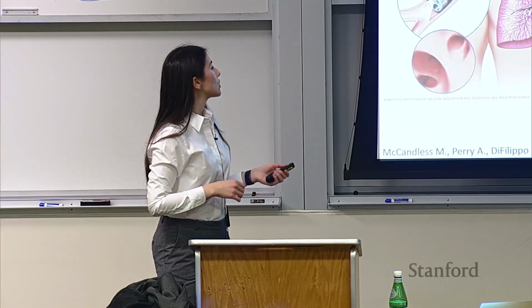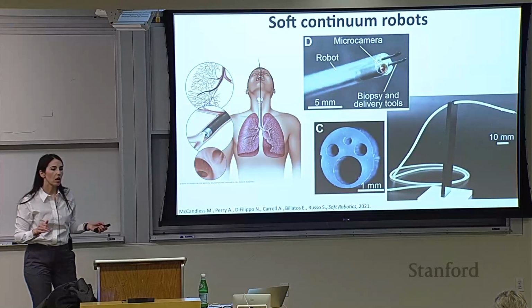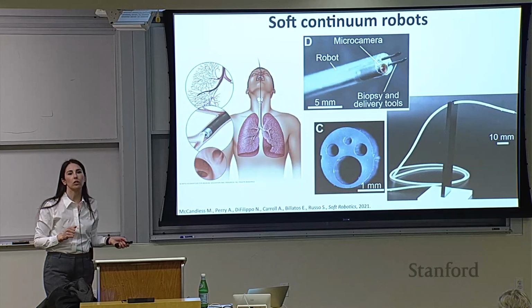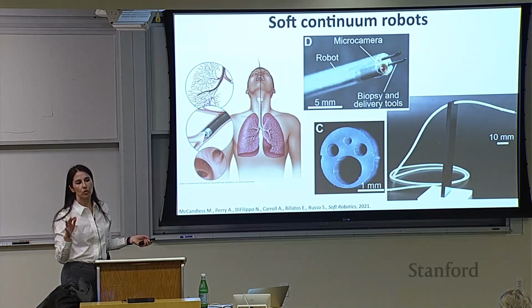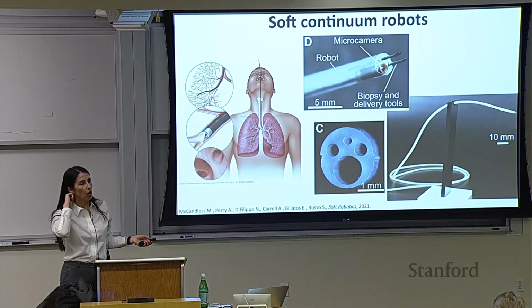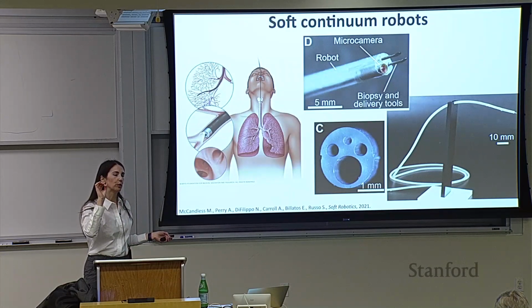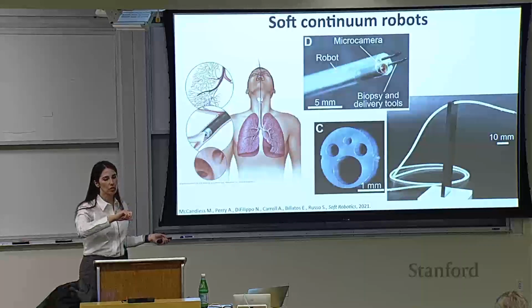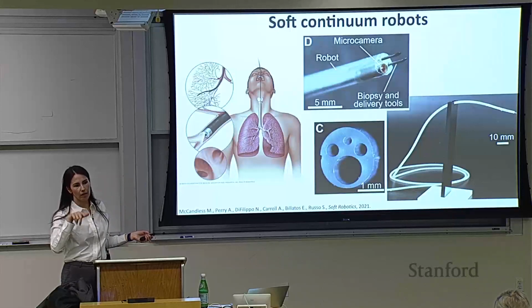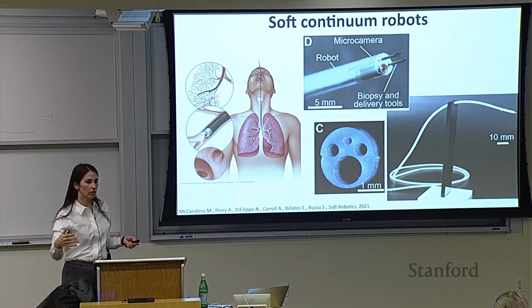Oh, yeah. So far, we still have to test it on live animal models. But if you're looking at a traditional bronchoscope, they typically range in diameter about 6 millimeters or so. There are some smaller ones, like pediatric bronchoscopes. However, the smaller you go, you don't really have working channels, so they're traditionally just for diagnostic procedures, not interventional tasks. You don't have any instrumentation passing through. So as you scale down these instruments, you lose some level of capability.